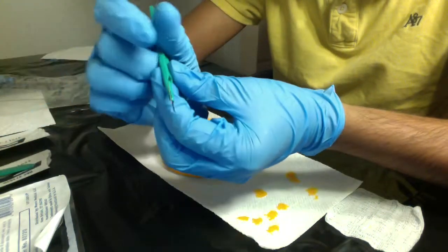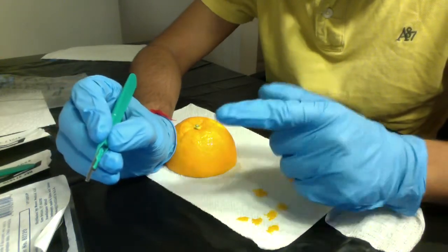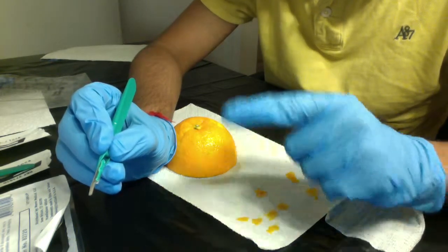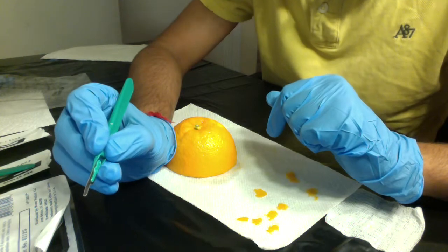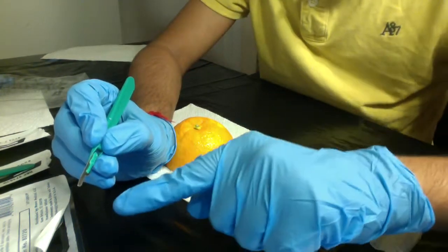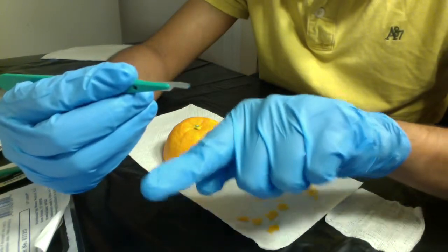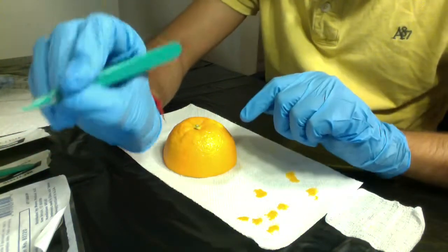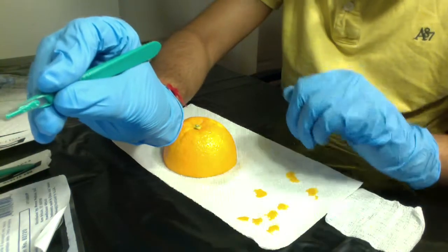and I'll be curling my fingers like a pencil and very close to the separation of the scalpel blade and the shaft of the scalpel. The other thing I'm making sure is I'm going to use the curved edge of the scalpel and not the tip of the scalpel. So just going to demonstrate my grip here.